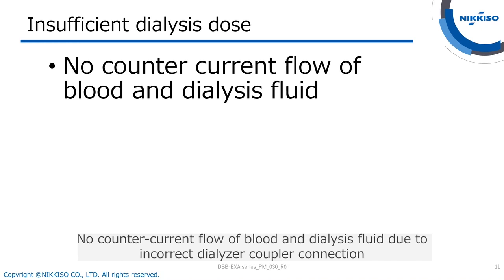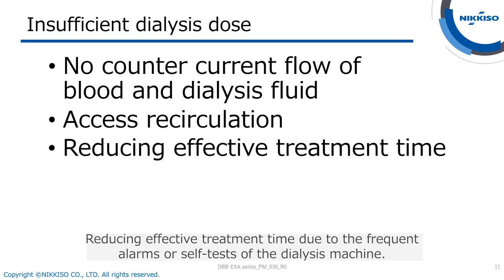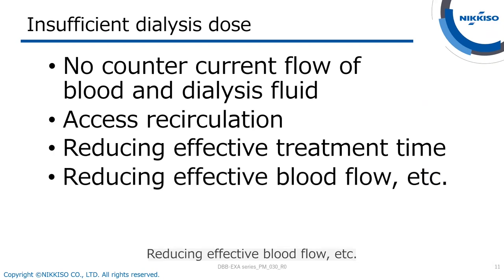No countercurrent flow of blood and dialysis fluid due to incorrect dialyzer coupler connection. Access recirculation. Reducing effective treatment time due to the frequent alarms or self-tests of the dialysis machine. Reducing effective blood flow, etc.